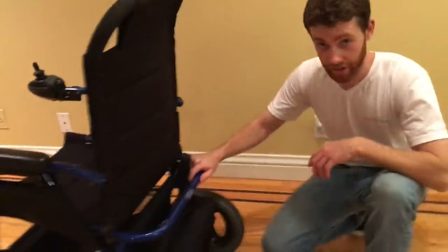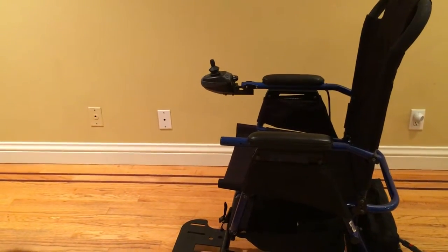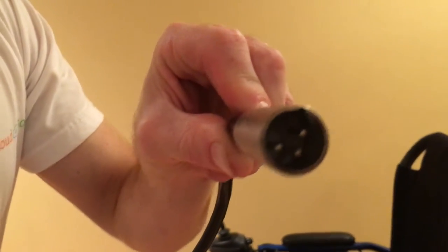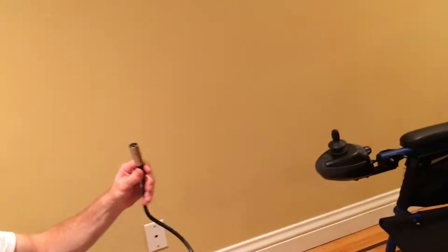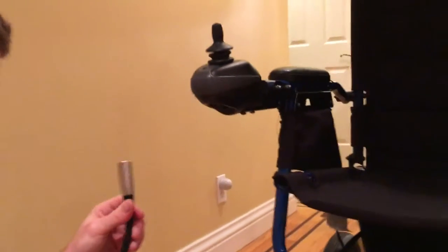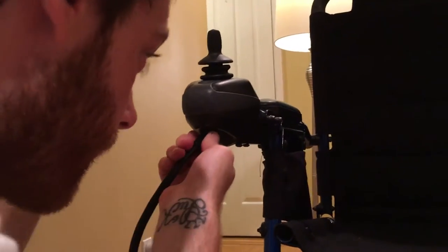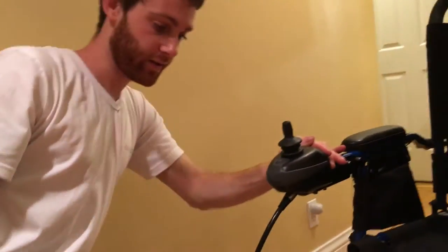To charge this power chair we have our standard battery pack. On the charger there are three prongs, and those three prongs attach to the joystick directly underneath. You want to align them up and attach. And that's how you charge your power chair.